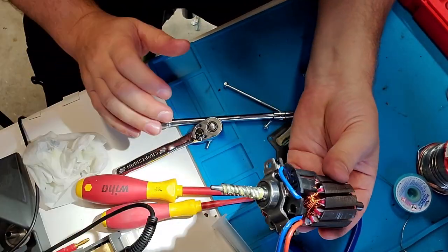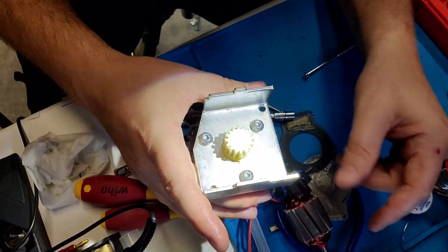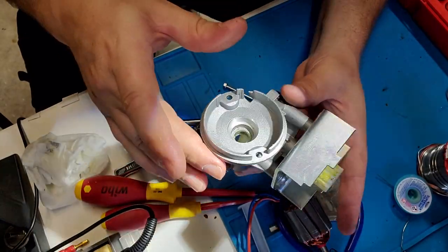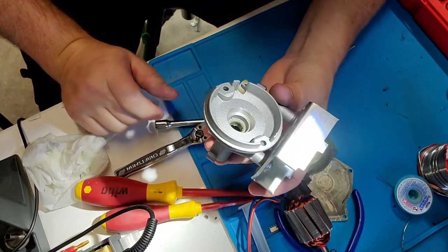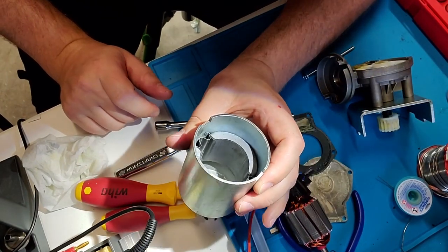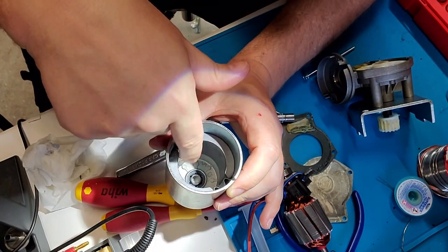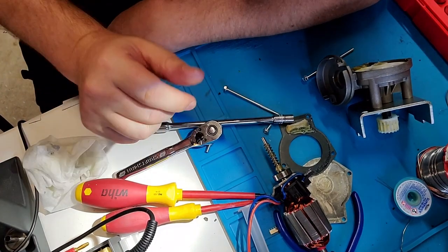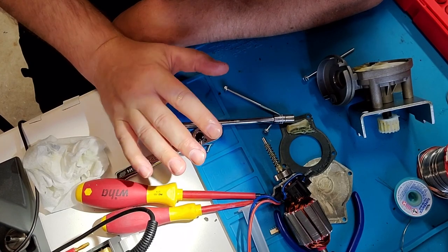So guys, this motor was actually fine. Everything about it was fine. The transmission was fine. It runs beautifully. The grease is still fresh. I have no idea why the motor on this patient lift was changed out. No idea at all. Normally, if there's some sort of breakdown, you'd see it right there by the brushes, or you'd see metal flakes appear by the stator magnets. But you don't have any of that. This motor is absolutely fine.